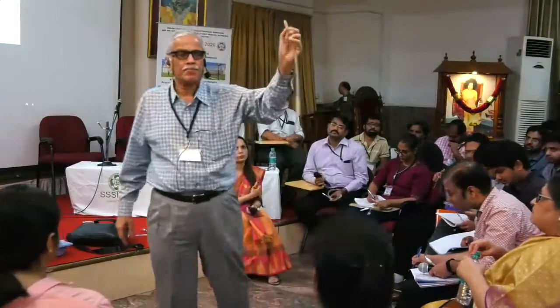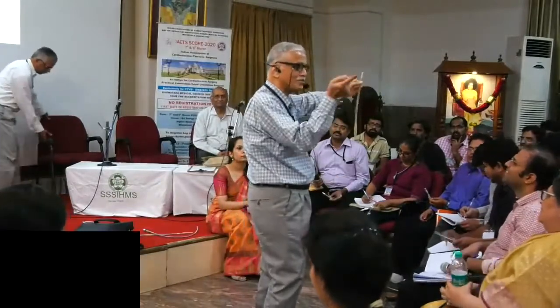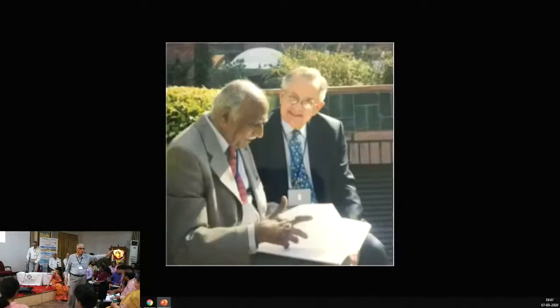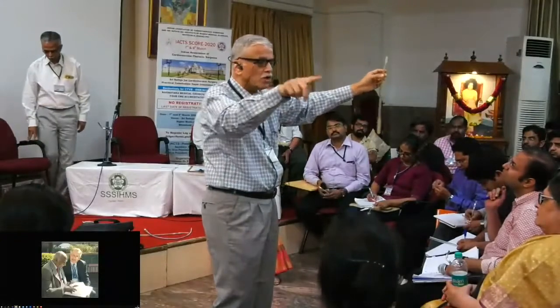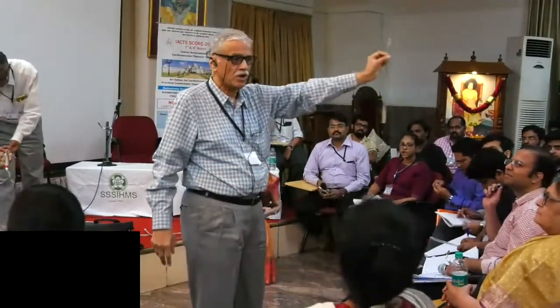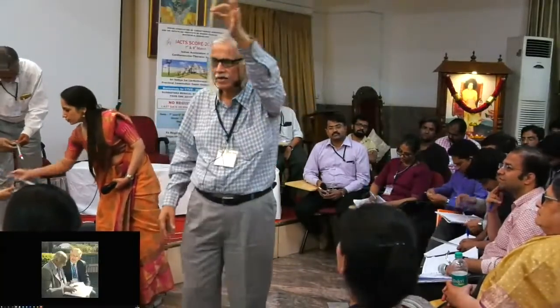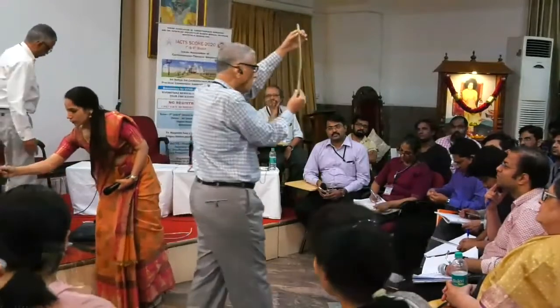Now look at the tip. It's a plastic tip or metal tip, that's what you have to see. It is a straight tip or curved tip. Understood? So what will this be? Straight plastic tip. For those who do not know Hindi, in your mind: this is a venous cannula, straight plastic tip, venous cannula. Understood? Number two, body.